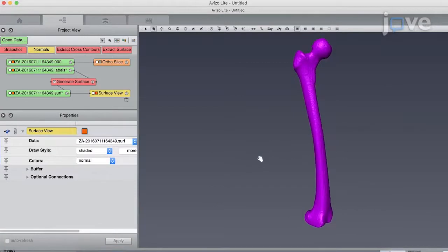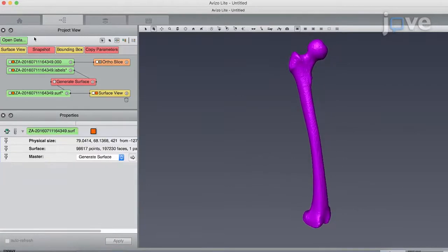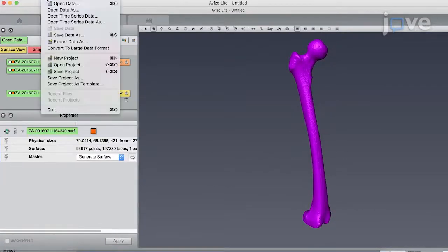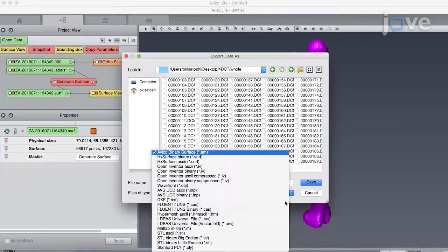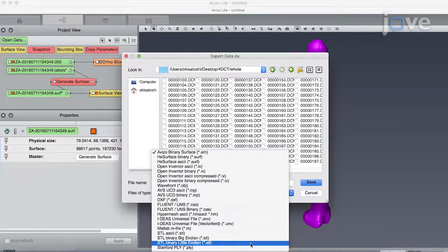To save the surface data in STL format, click File and Export Data As and select STL Binary Little Endian.